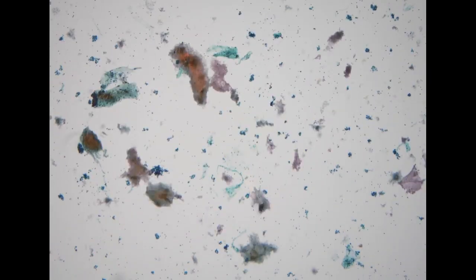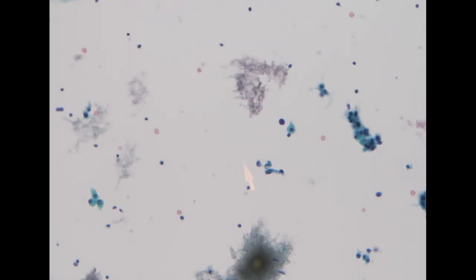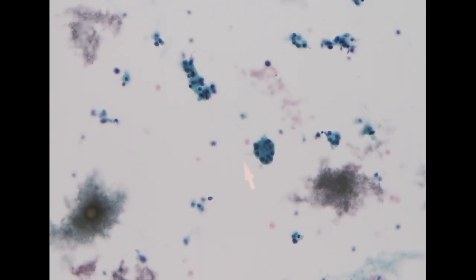On low power, you can see there is some background bleeding. So we see RBC, and there are small clusters of larger cells throughout the entire specimen. In the background, we didn't see much colloid.